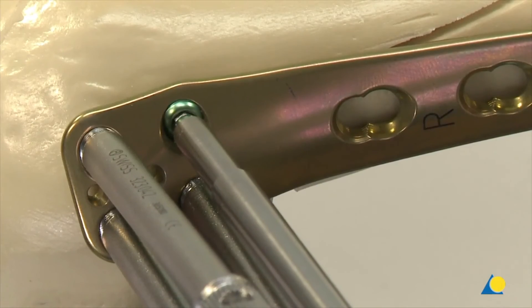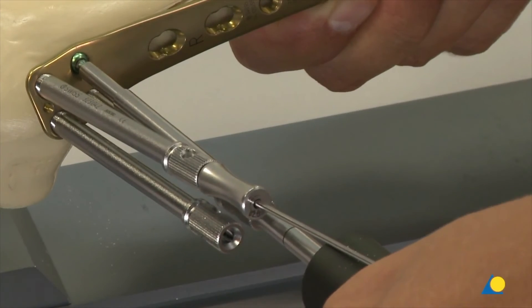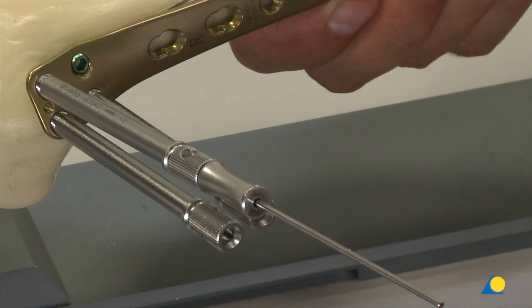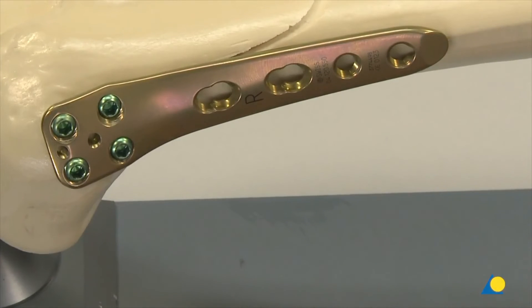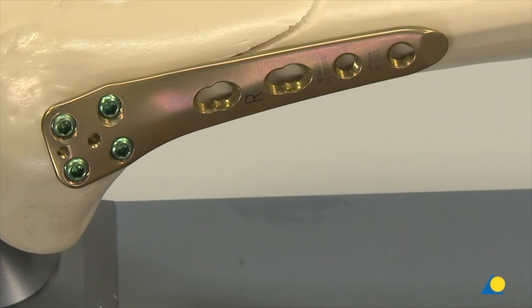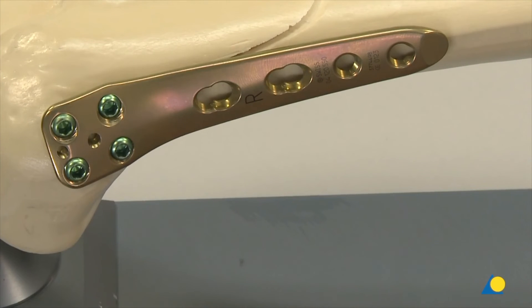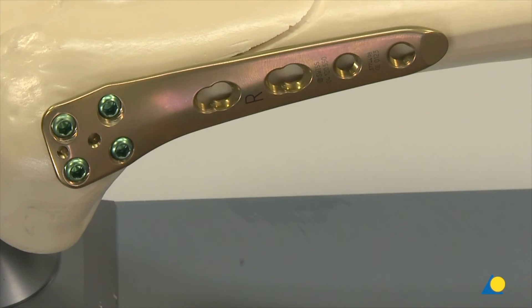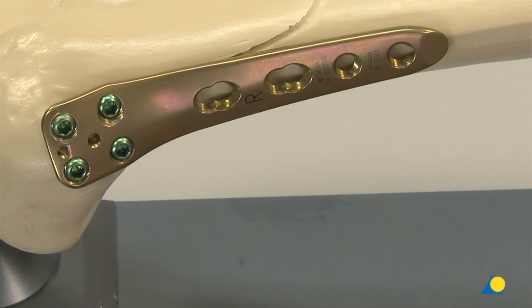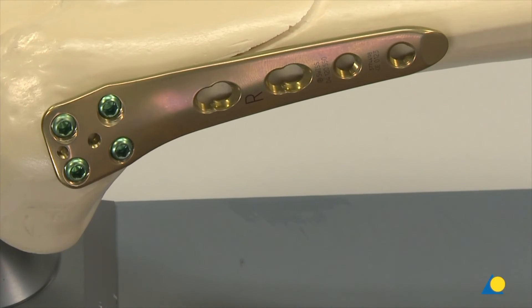The optimum torque has been reached once the first click has been heard and felt. The same procedure is used to insert the screws in holes C and D. Then the K-wire in hole A is removed and replaced with a locking screw using the same technique. The image intensifier is used to ensure that the screws do not penetrate the intracondylar notch.